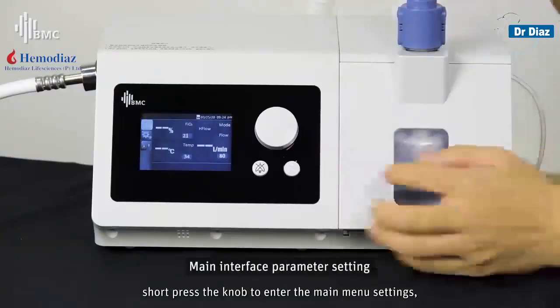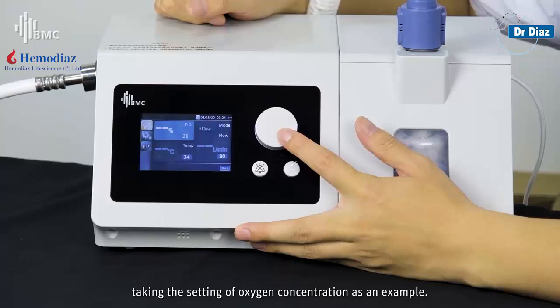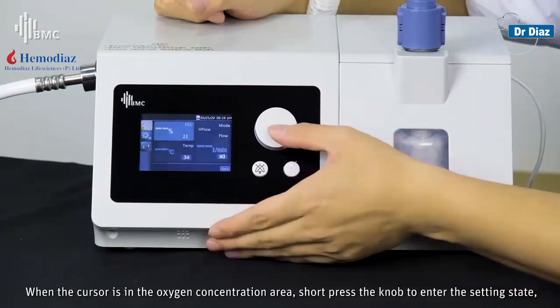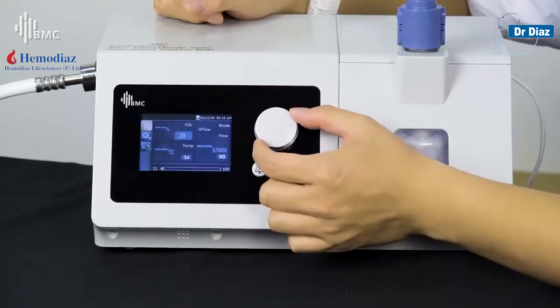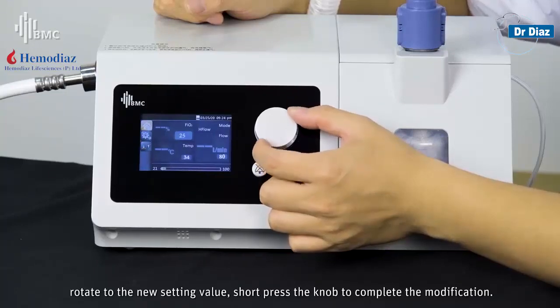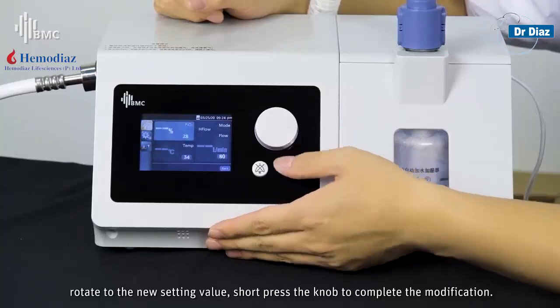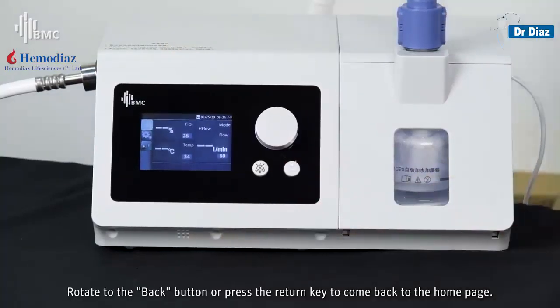Short-press the knob to enter the main menu settings. Taking the target oxygen concentration setting as an example: when the cursor is in the oxygen concentration area, short-press the knob to enter the target setting state, rotate to the new target value, then short-press the knob to complete the modification. Rotate or press the return key to come back to the home page.